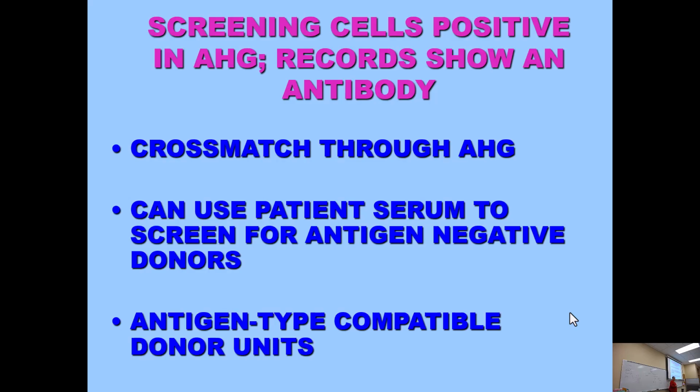We can use our patient serum to screen for antigen-negative donors if we need to, and we can antigen type the compatible donor units.